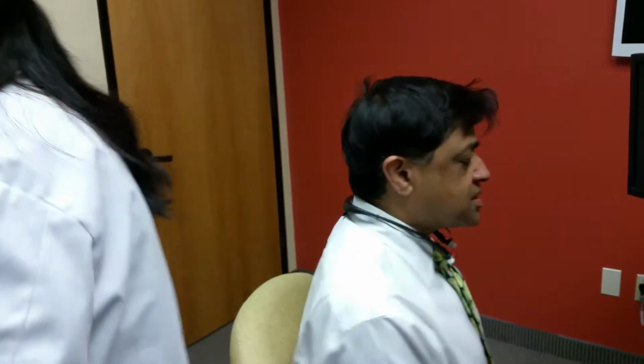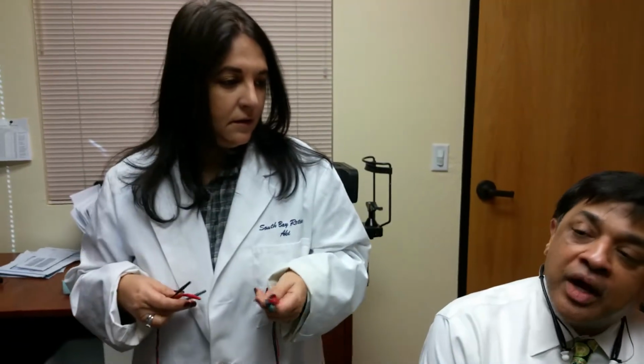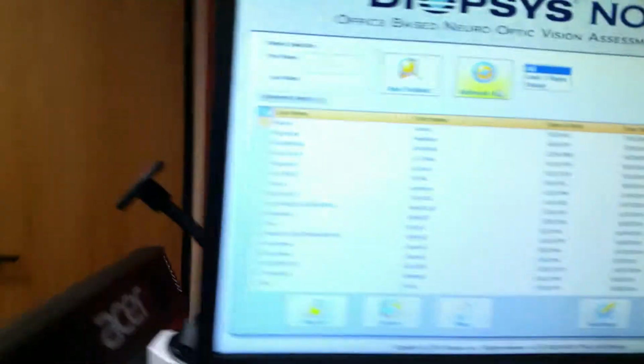So you don't wear any type of correction? Yep, I have contact lenses. And they're single vision? RGP. Oh no, they're not single vision? No, I have a fancy multifocal in the right. Okay, well that's going to mess with our test results. Keep that in mind, she's going to do it for practice anyway. You want to make sure that she gets the hands on. But you don't want to base anything off of the test results that we're going to get for that right eye, because it's multifocal. So come in one morning without them in, put on a pair of glasses and let them test you to get a true single vision reading on you. Today we'll do it this way, and then we'll do it another day with the glasses, obviously.